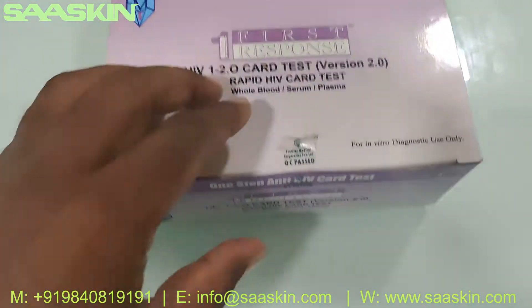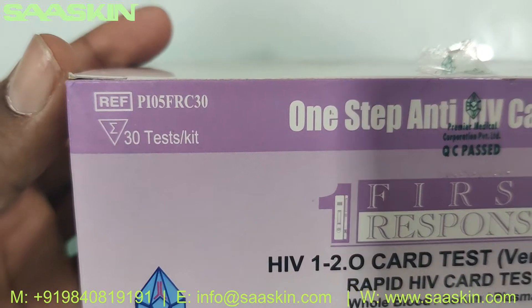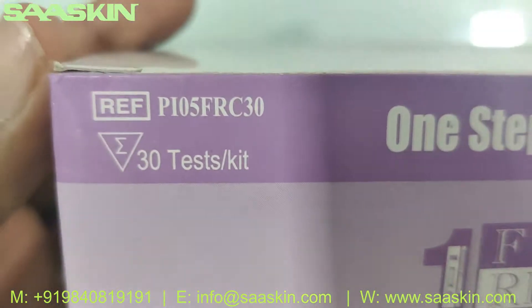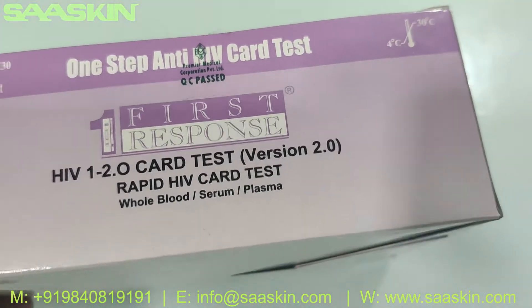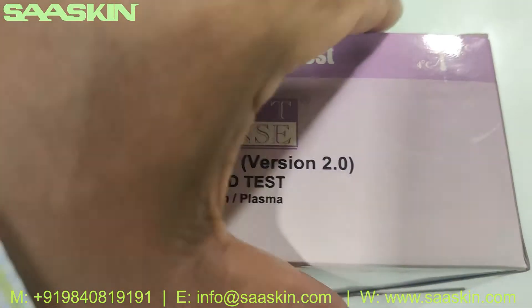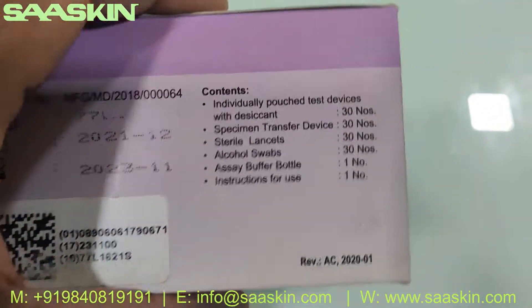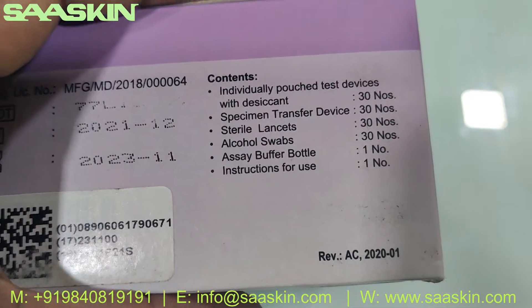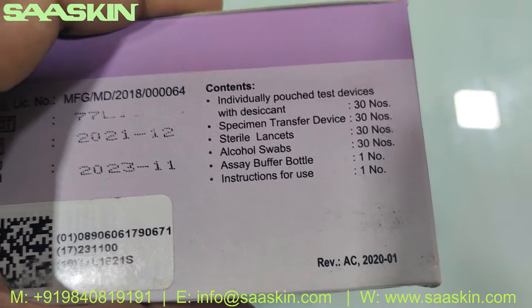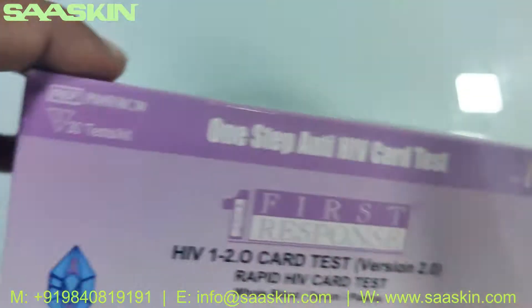This is a WHO pre-qualified kit. Let me show you around the kit. You can see that it's a 30-test kit pack, and the reference part number is 'One Step Anti-HIV Card Test' for whole blood, serum, and plasma. It has a standard two-year validity. Inside you can see 30 devices, 30 specimen transfer devices, lancets, swabs, a buffer bottle, and an IFU.